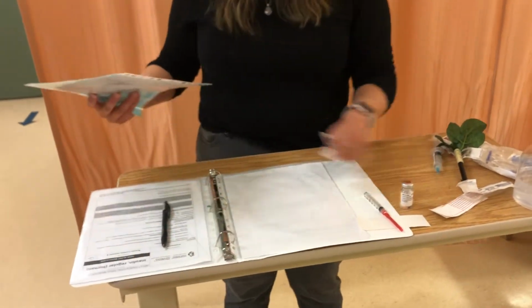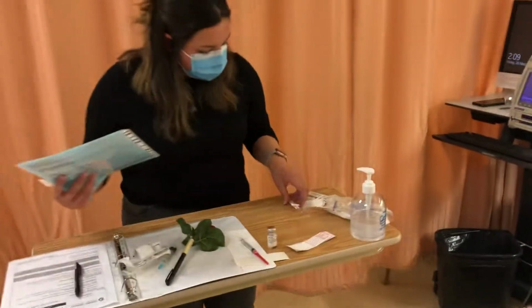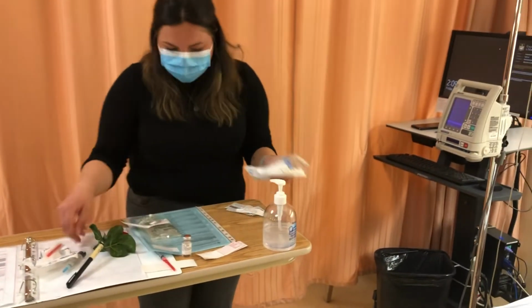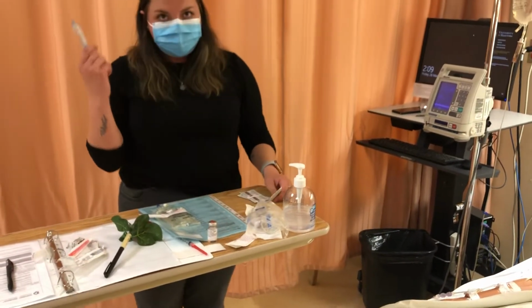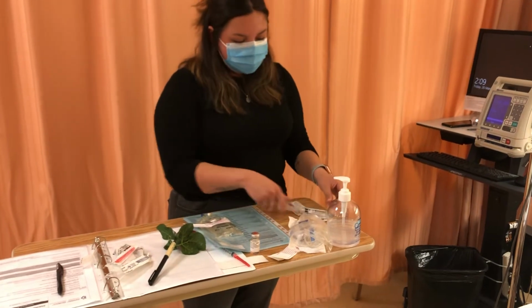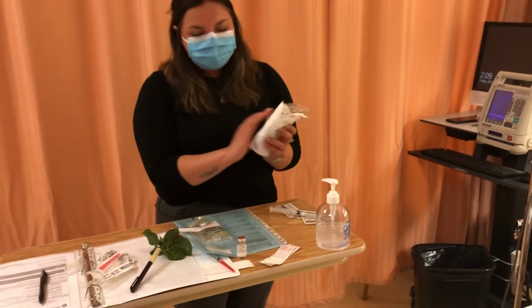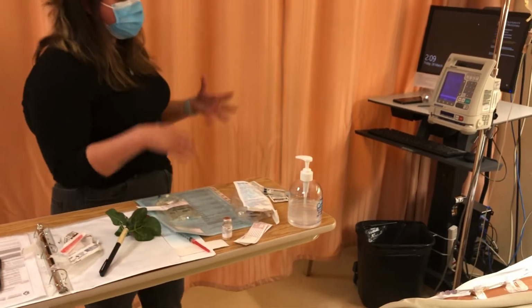So now that my checks are complete, I can go to the bedside. To the bedside, I'm bringing a swab, a syringe to ensure the patency, and some portless tubing. So I'm entering my patient's room. I'm doing my entrance safety check.